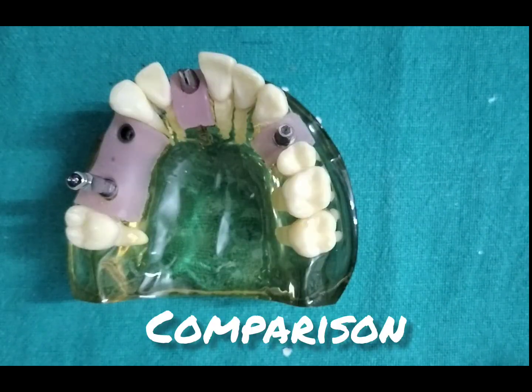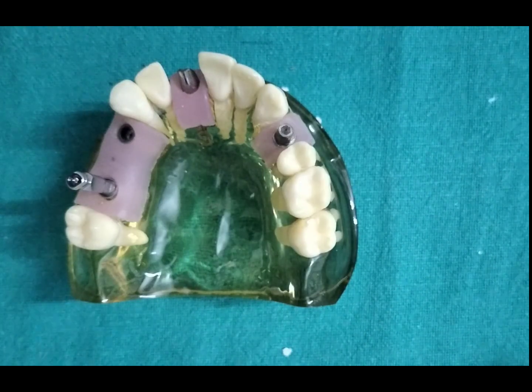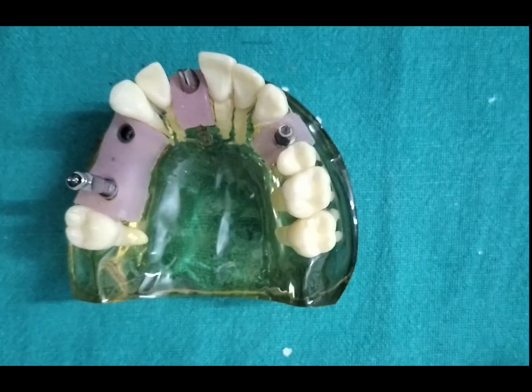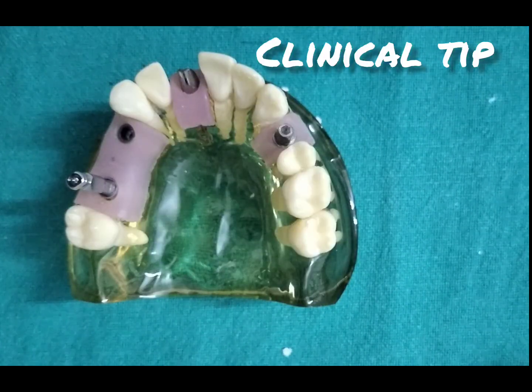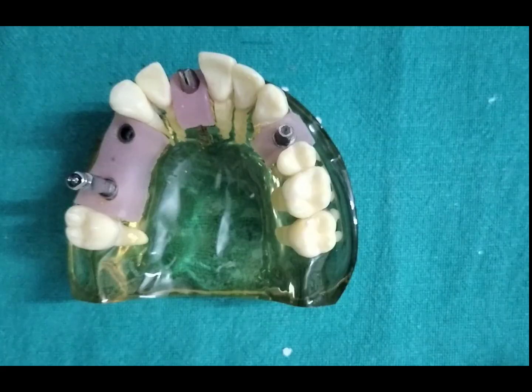So if we have to compare between the open tray and the closed tray, the open tray is a direct technique, whereas the closed tray is an indirect technique. Open tray is used for multiple implants, closed tray is used for single implants, and coping in open tray is picked up during the impression, whereas coping remains in the mouth in a closed tray technique. So clinical recommendation, this is very important to understand: for single implant, closed tray impression technique works very well. For multiple implants, open tray technique is generally preferred because of superior accuracy.